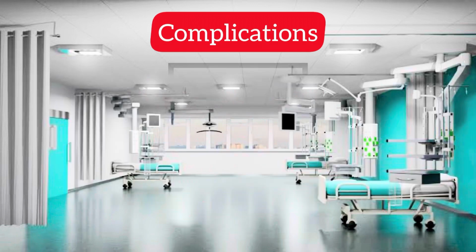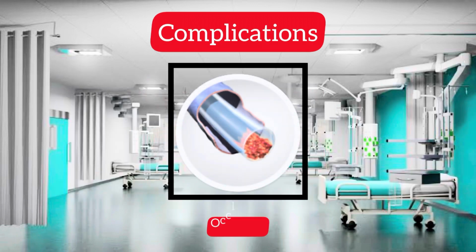Catheter occlusion. Catheter occlusion can occur as a result of thrombotic and non-thrombotic causes. A blood clot is the most common cause of catheter occlusions. Other causes of occlusion can be non-thrombotic. Malpositioning, such as catheter abutment against the wall of a vessel or kinking, can cause occlusion. Additionally, drug precipitation among incompatible medications and solutions can block the catheter. Common drugs known to precipitate are etoposide, calcium, diazepam, phenytoin, heparin, and total parenteral nutrition.